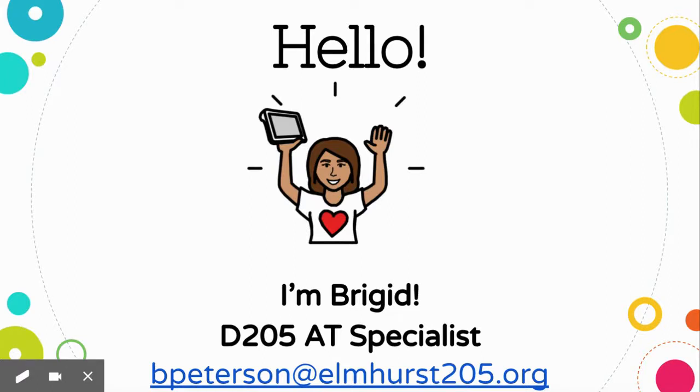I'm happy to help you troubleshoot or work on something you want to do with the AAC device. We can always set up a Zoom meeting to work together face-to-face. Once you've completed this training, we'll schedule a follow-up meeting where I can answer any questions you have. We can practice modeling together and practice making edits to a couple of buttons. I'm here to help, so feel free to ask me anything.